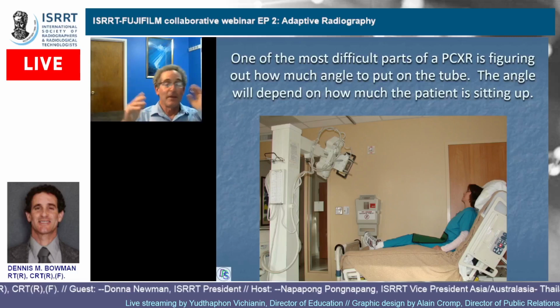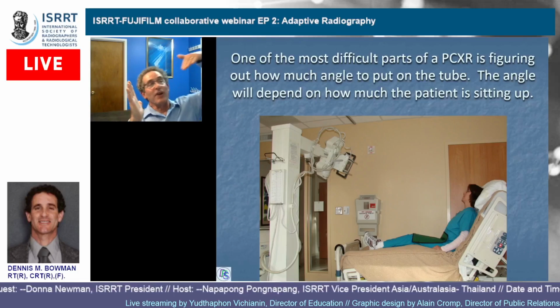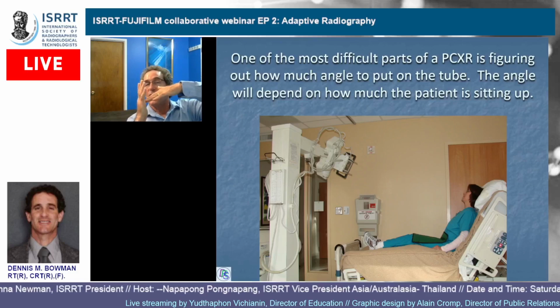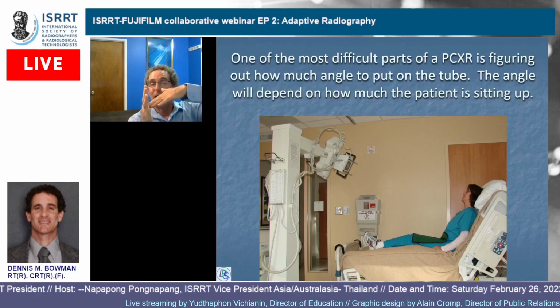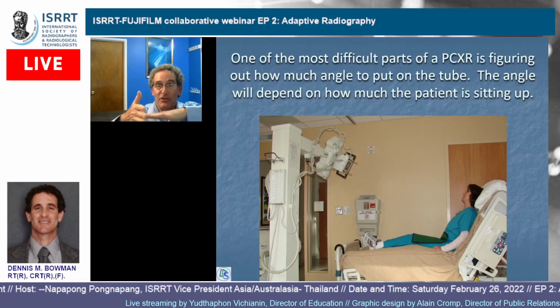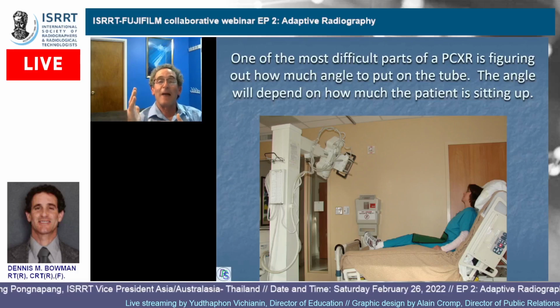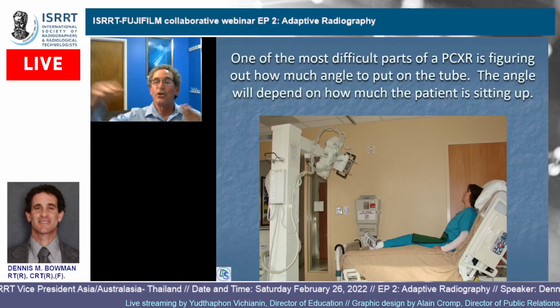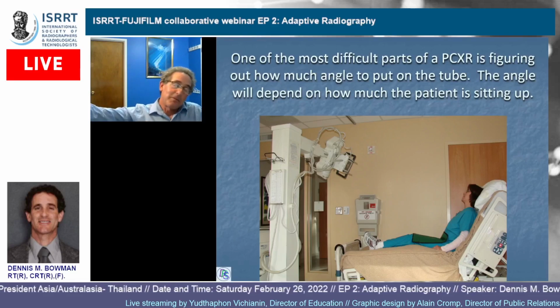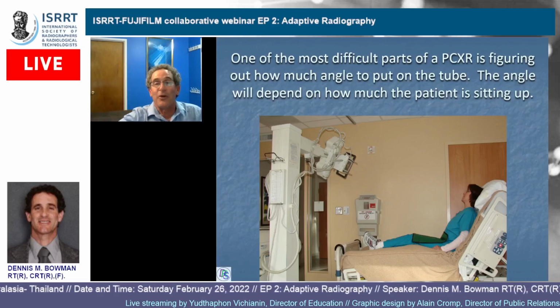Then you're thinking, well, I'll see it on the chest x-ray. Yeah, but you've got all kinds of angle on your chest x-ray, so you might have just disappeared your air fluid and free air. That really makes a difference in how well you're shooting that decube or upright abdomen. So it's something to always be aware of when you're counting on your chest, but your chest was not for that.